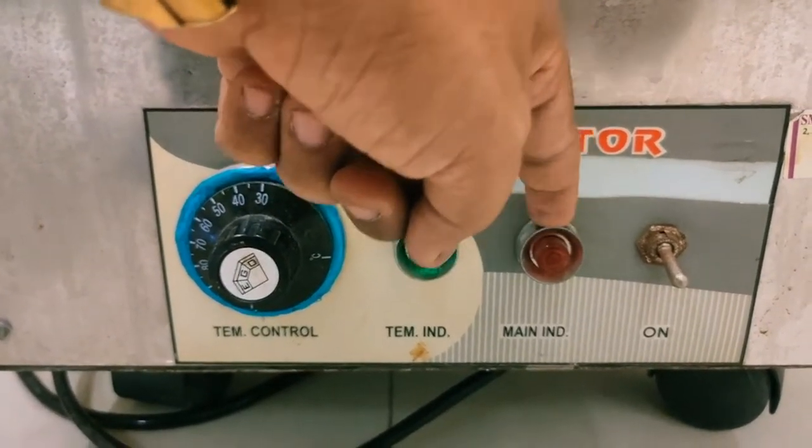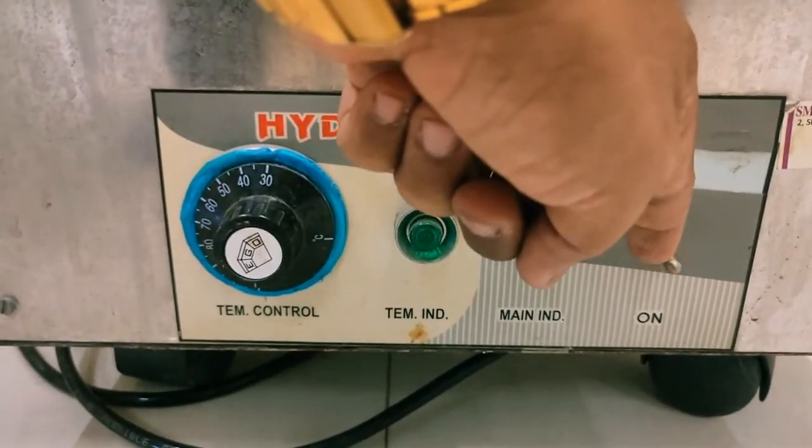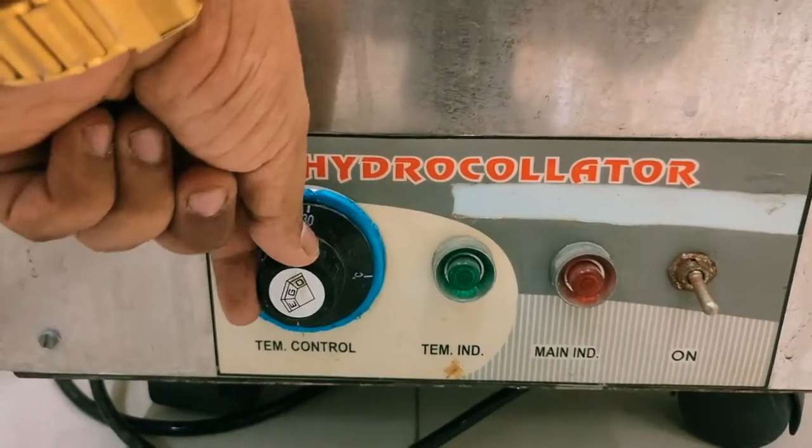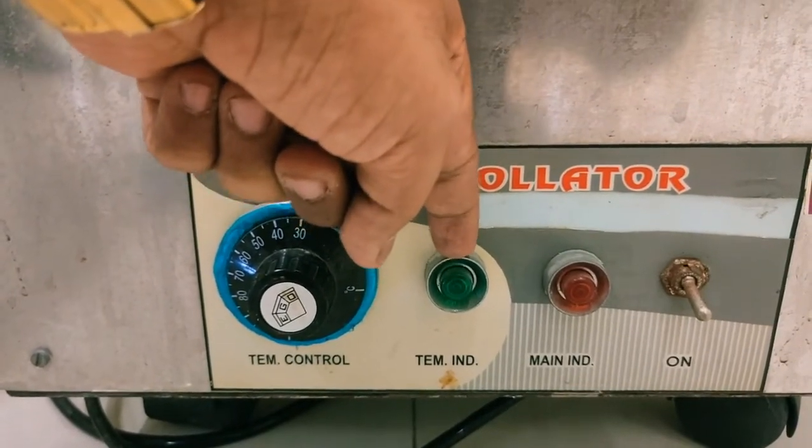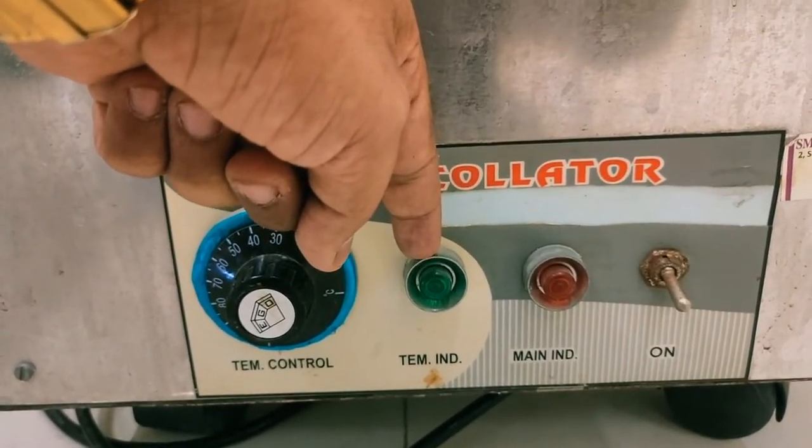This is the main indicator light — it will glow when you switch it on. Whenever you are increasing the temperature, this will indicate that the machine is working properly.